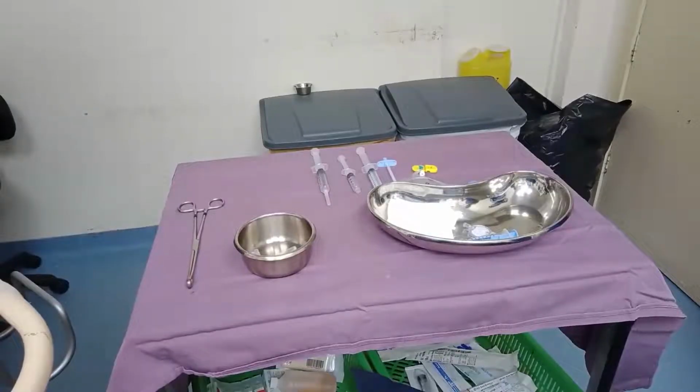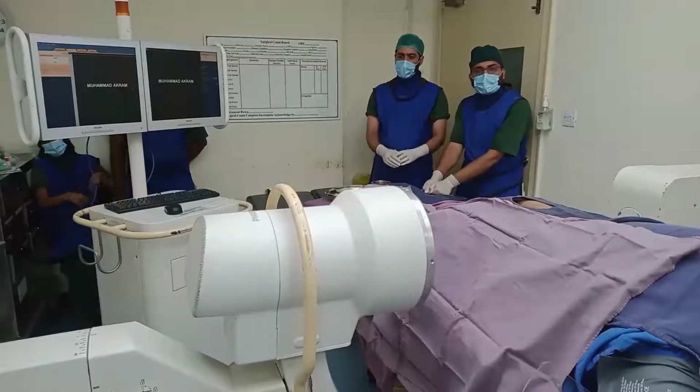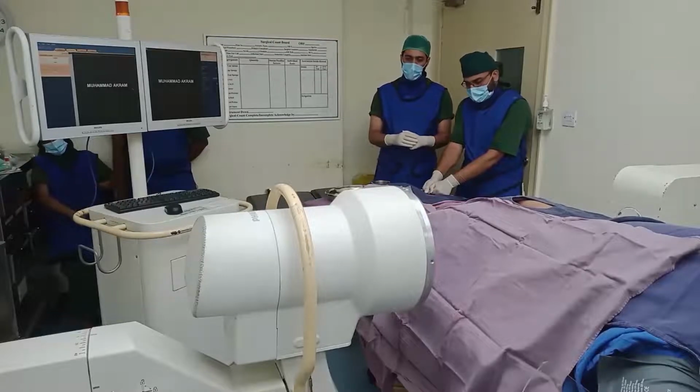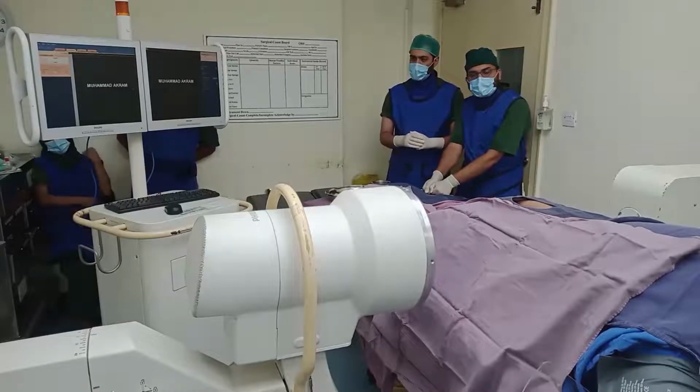To emphasize the point about the chlorhexidine, as you can see, after the patient is prepped with the skin prep, the chlorhexidine is not returned to the procedural trolley. This is the shallow angle technique for doing caudal neuroplasty. The C-arm view is lateral.